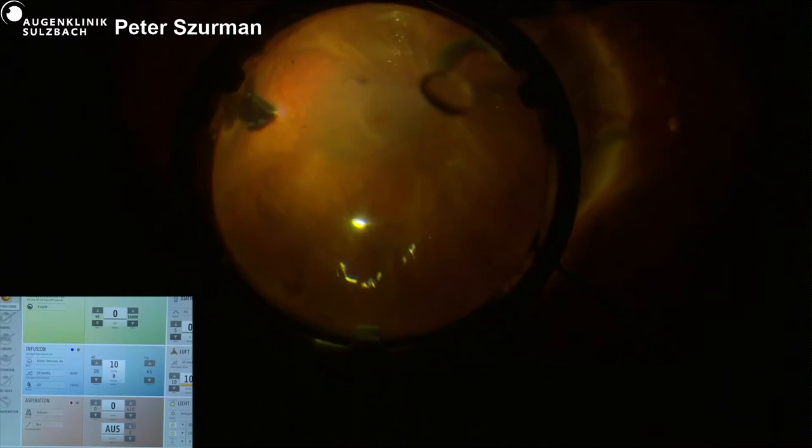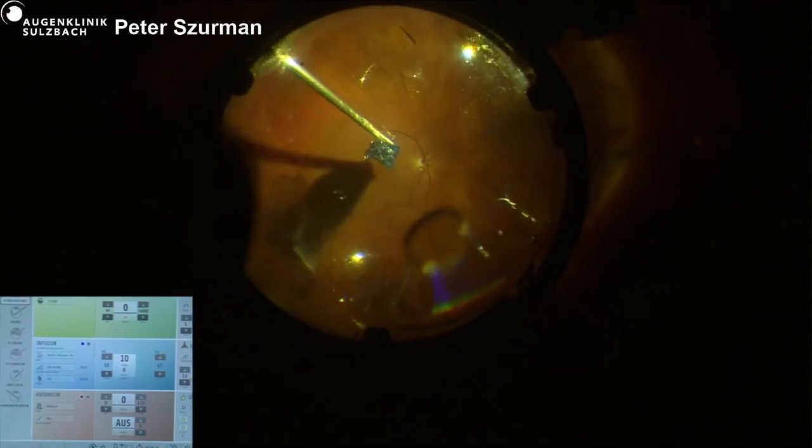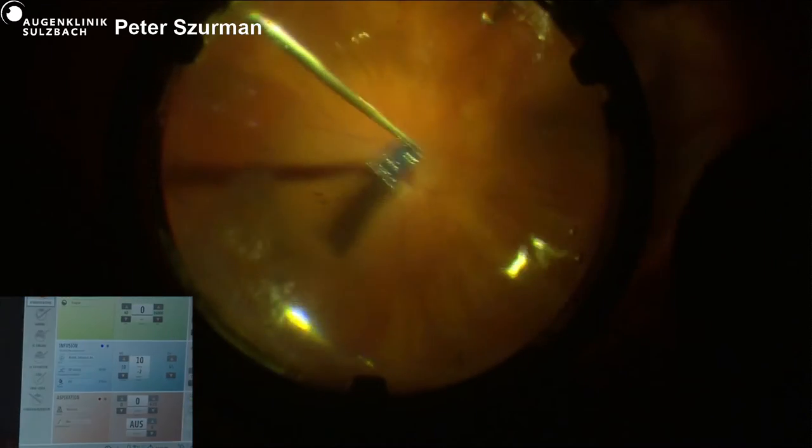Yeah, I use the same technique. Smaller forceps, and it goes in pretty easily. Yes, and there are several techniques. And you are already under air. Yes, I've used both techniques. Once under PFCL.